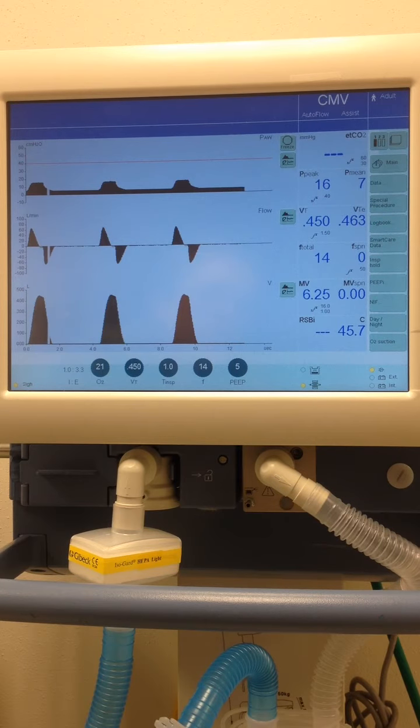on that 450. So what happens if we change our compliance? If our compliance decreases from 40 to 20, what would we expect to happen? Well, just like the other ventilators, we are going to expect a drop in our tidal volume because we're now in a pressure-controlled mode, and we will see the ventilator deliver that volume breath to measure where we are, and it will then adjust its pressure-controlled breaths to get us back up to that 450 volume target.